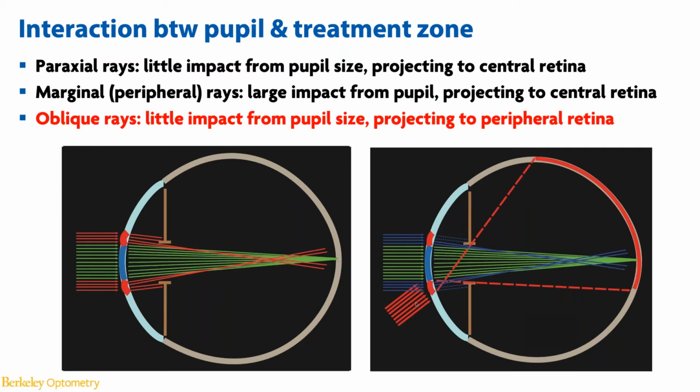These are the rays that are coming into the visual system from an oblique angle. So if we're talking about the impact of the paracentral steepening on the peripheral retina, the retina projecting to the with some level of eccentricity, this has to be the oblique rays, meaning the light rays coming from an angle. As you can see from the ray tracing or the simplified diagram here, it's the pupil margin on the opposite side, on the contralateral side, that basically delineates how far you can project.